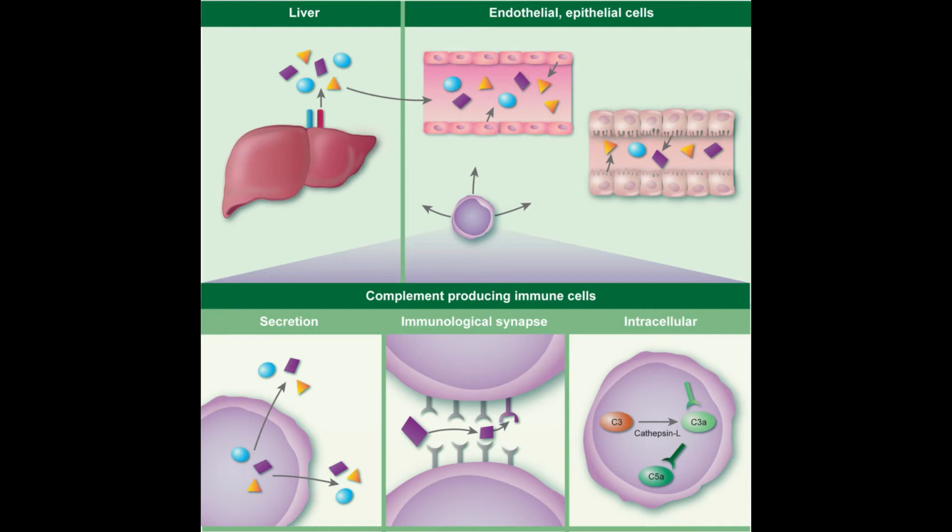One test has been developed that can determine the activity of all three pathways: the classical pathway, the alternative pathway, and the mannose binding lectin pathway. In this test system, strips used for the classical pathway are coated with IgM. Strips for the alternative pathway are coated with the lipopolysaccharide, and strips for the mannose binding lectin pathway are coated with mannose. Such testing is easy to perform and is not dependent upon the use of animal erythrocytes, which may be hard to obtain. Deficiency can be detected using combined test results.